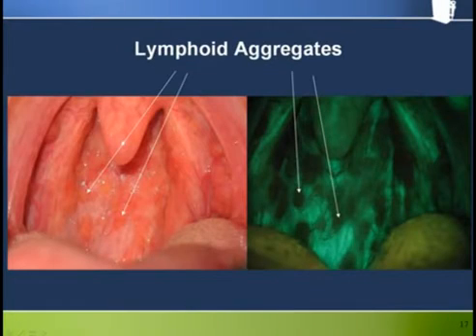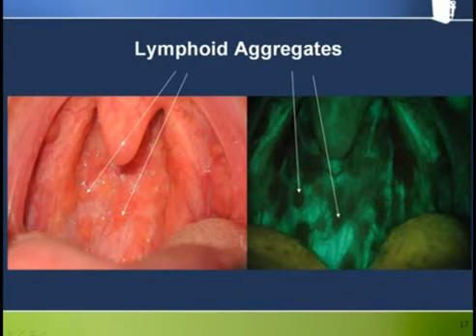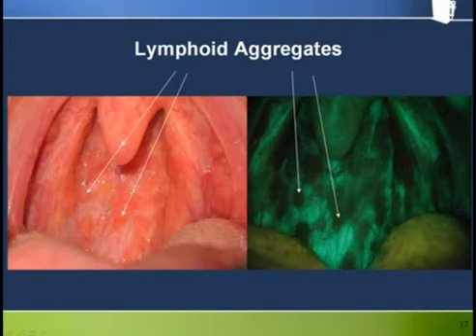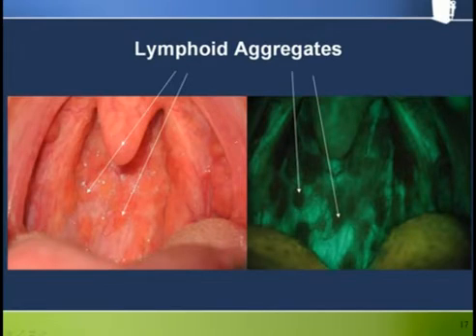Occasionally, collections of so-called lymphoid aggregates can populate the rear oropharyngeal wall and, because of their blood content, have a strikingly dark appearance when viewed under fluorescence visualization. Close examination of this same area under white light reveals that these dark areas exactly correspond to the red nodules of lymphoid tissue. These are a normal variant that are completely benign.